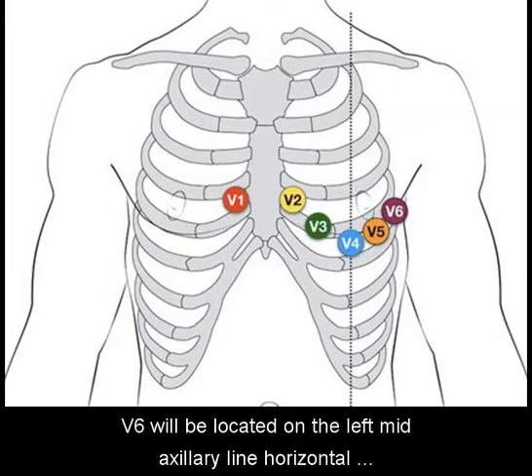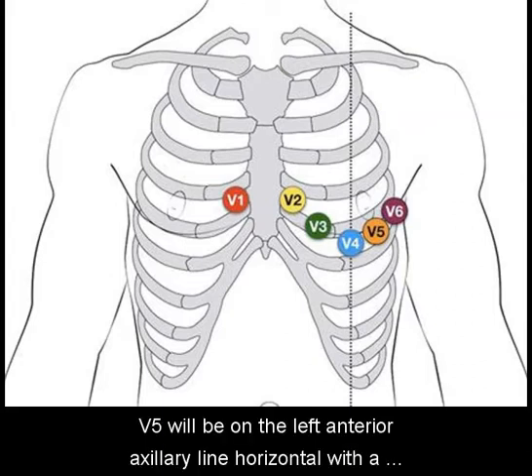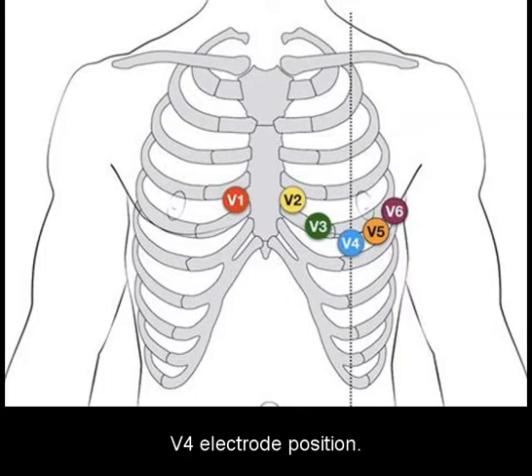V6 will be located on the left midaxillary line, horizontal with the V4 electrode position. V5 will be on the left anterior axillary line, horizontal with the V4 electrode position.